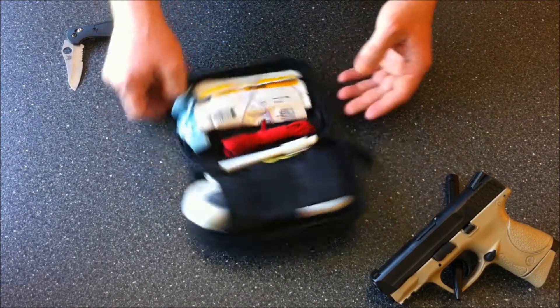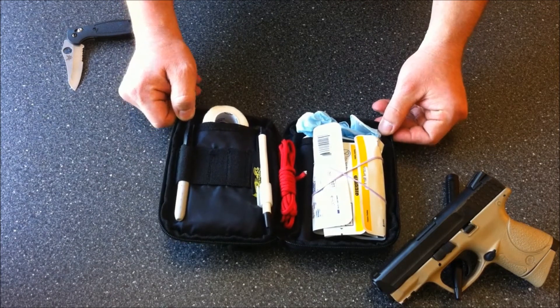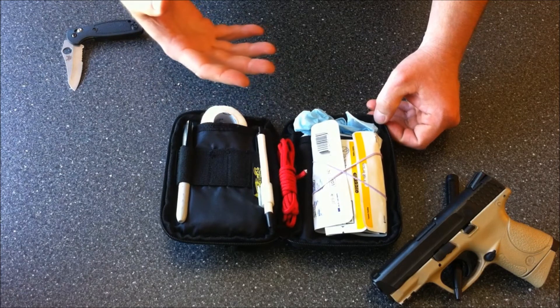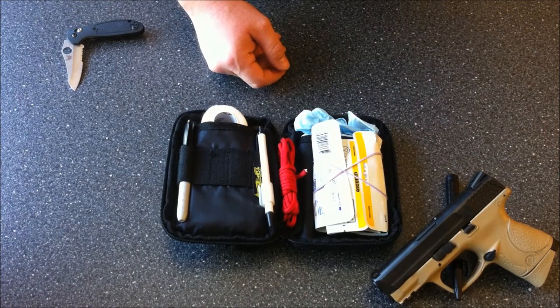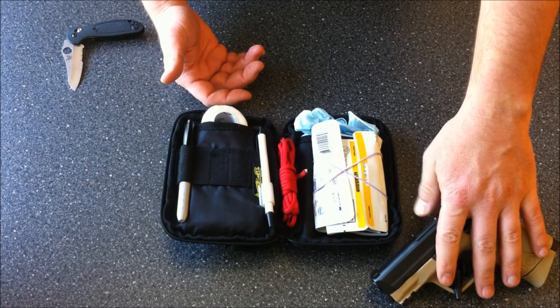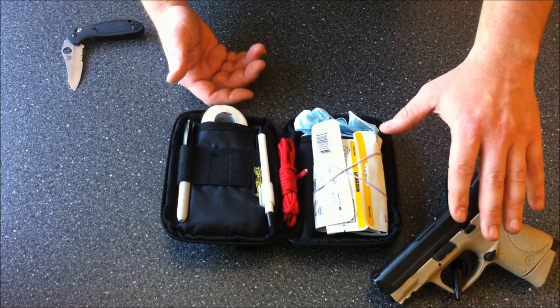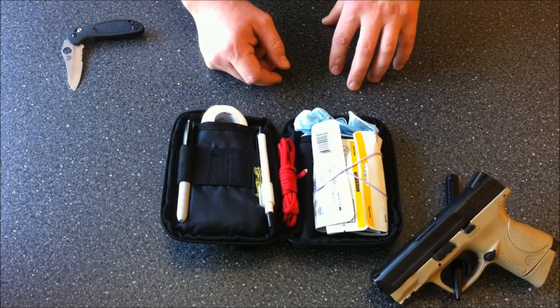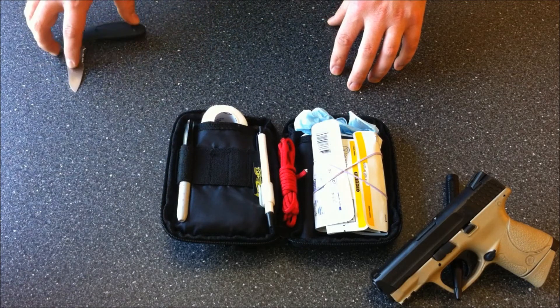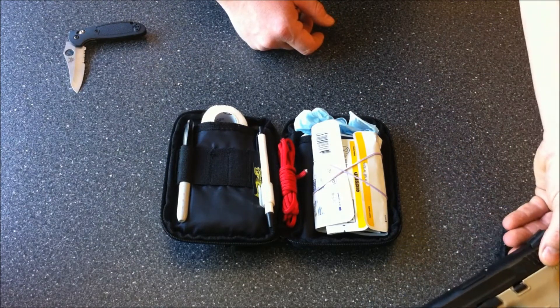Nothing in here is rocket science or trauma surgeon level — it's pretty basic. The idea of the kit is just to start the ball rolling on stopping blood loss from penetrating trauma. So if you have an accidental discharge, been involved in a conflict, been assaulted with a weapon, or struck by a sharp instrument such as a knife or a shank.